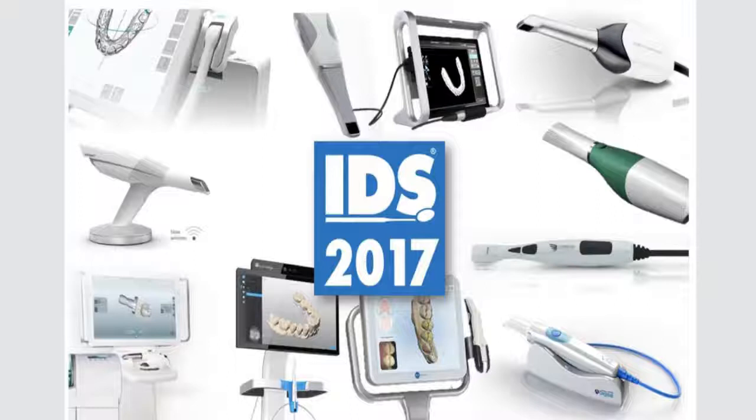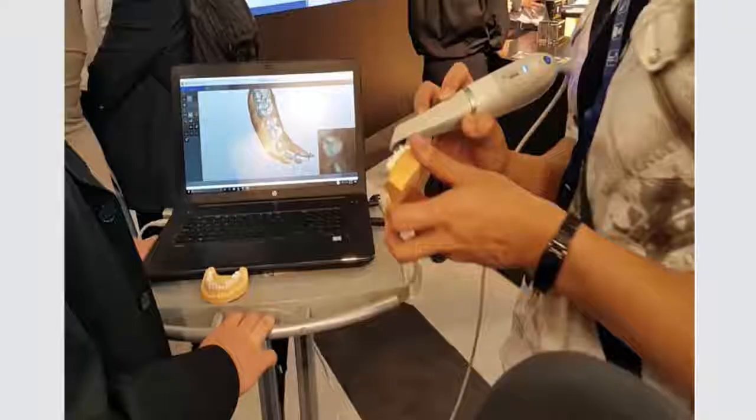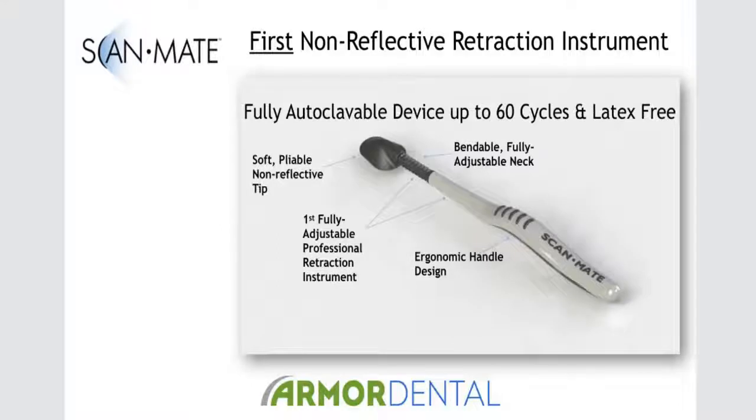Now at the IDS thing in 2017, the biggest thing that we were talking about and looking at besides 3D printers was intraoral scanners, and there are so many on the market today. But the concept is, of course, to digitize the information from the patient's mouth to the computer so that we can, in fact, create the restorations and create the plans to be able to merge the different technologies together.